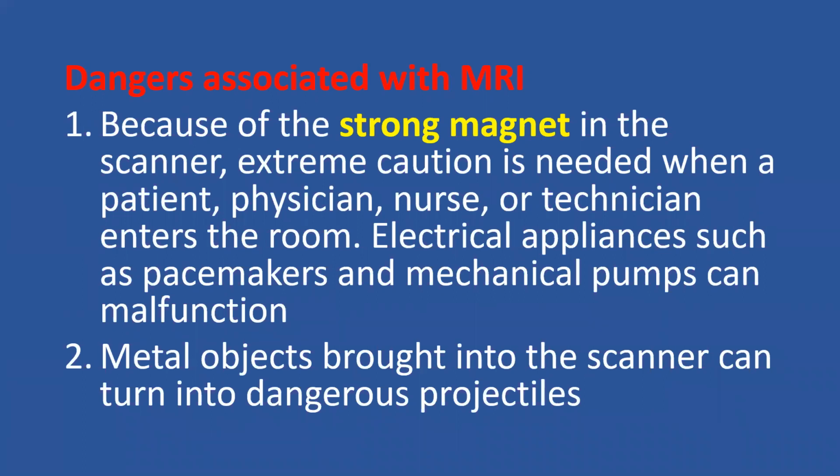Extreme caution is needed when a patient, physician, nurse, or technician enters the room. I've noticed that many centers don't even put this warning on the door.